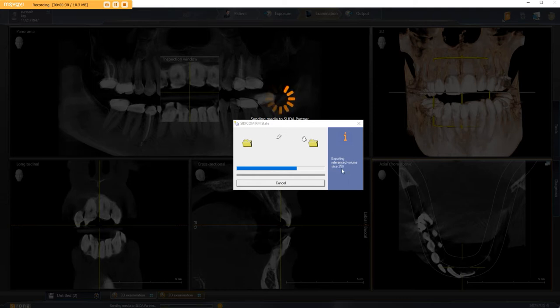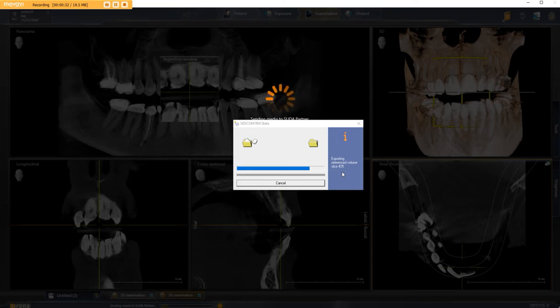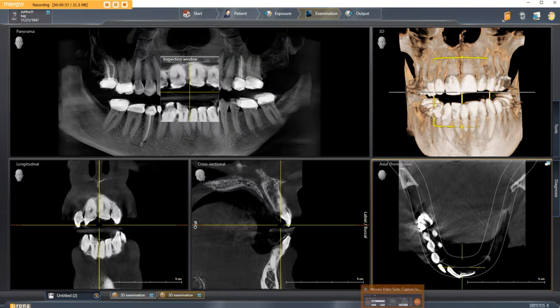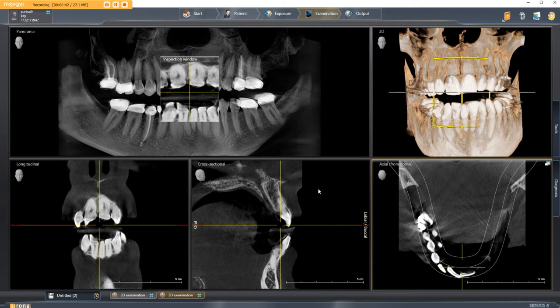It'll be about 500 slices, a very large folder. It's important that when you scan for cone beam for CT planning, you scan the patient with the high resolution off. You want to scan it in low res.